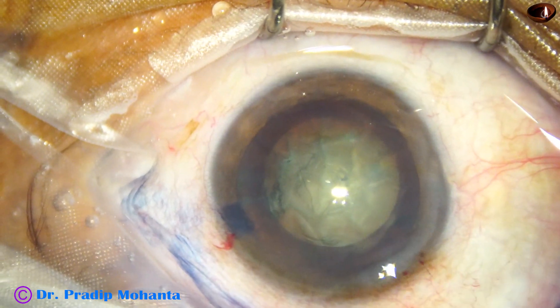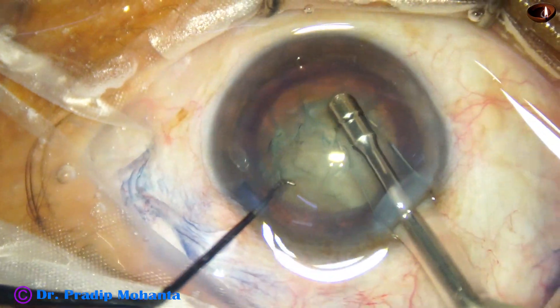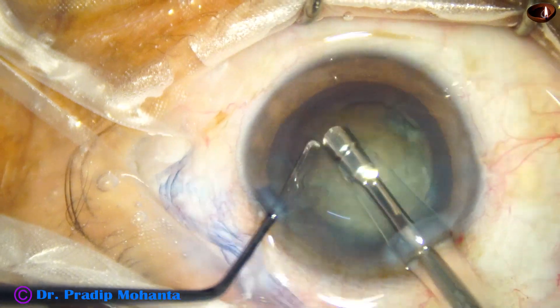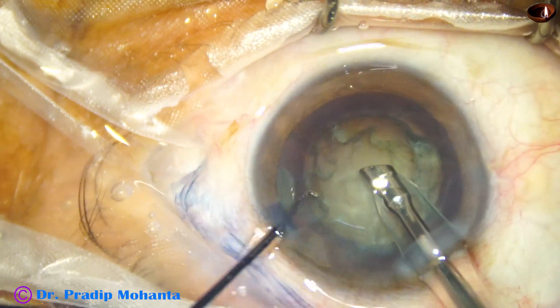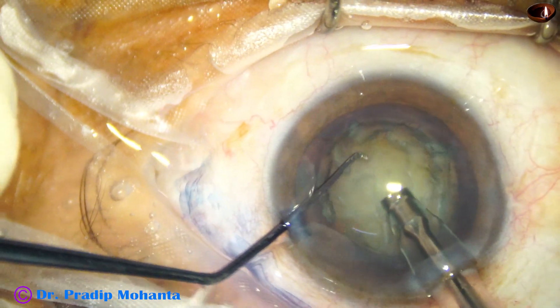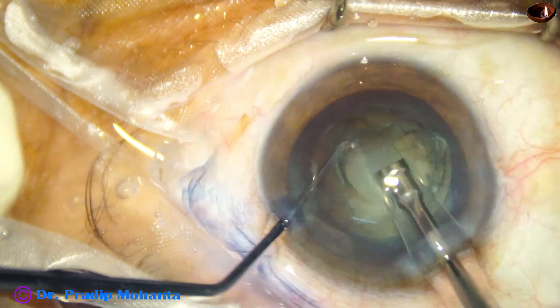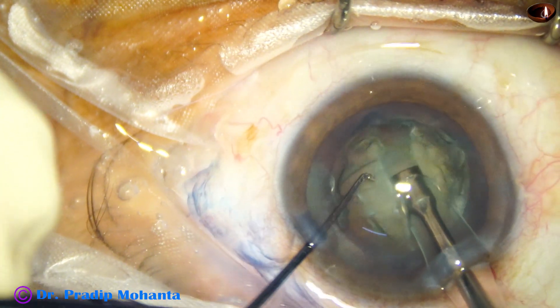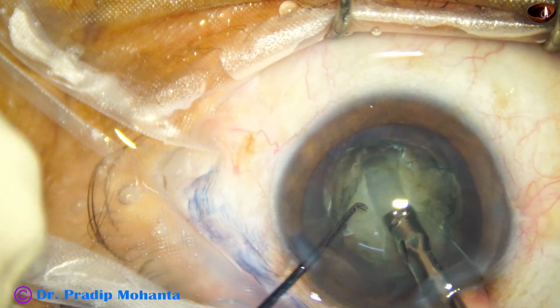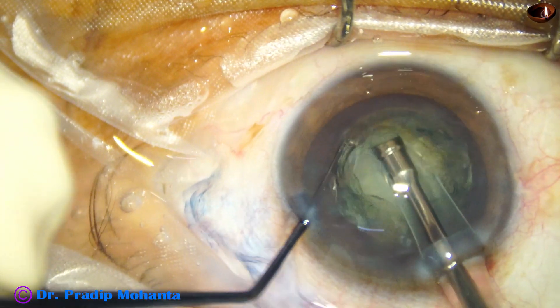The anterior chamber is filled up with viscoelastic, and we are going to make a trench along the middle of the lens mass. The main incision is at 11 o'clock, so the trench will go from 11 o'clock to 5 o'clock. We must not push the nucleus; we must apply ultrasonic energy to emulsify the matter in front and then go forward. Ultrasound is used only when we go forward, and we must stop ultrasound when we come backward.